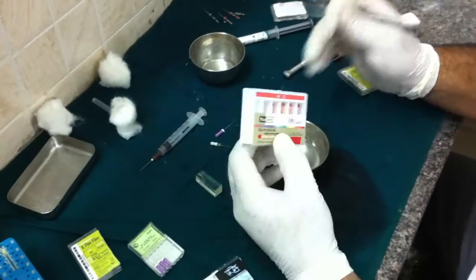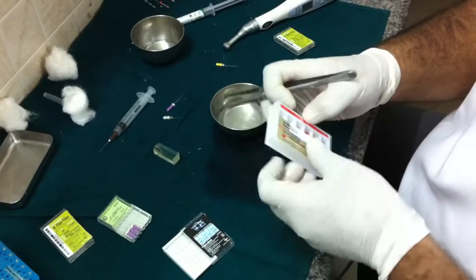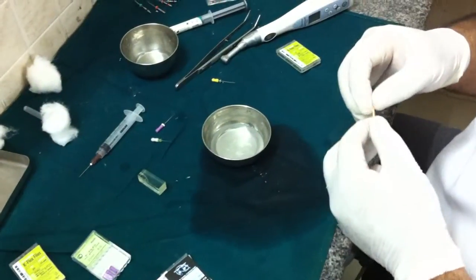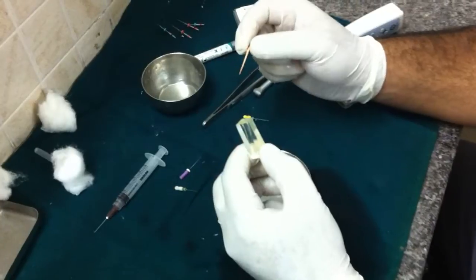Now, there is a slight change here. I am using a regular gutta-percha, a 25 6% GP, not the 30 6%. The reason is that even though the file is 30 6%, since they are twisted, there is some loss of diameter.